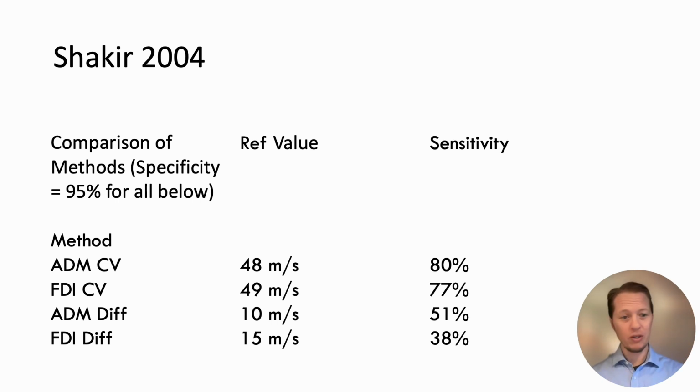When you check the sensitivity, yeah, an absolute conduction at 48 to the ADM, which is, again, traditionally what many of us do. You check at abductor digiti minimi. You don't check FDI. That's probably because everyone else before you checked it that way, so that's how you learn to do it. You should probably do both. You get a better sensitivity.